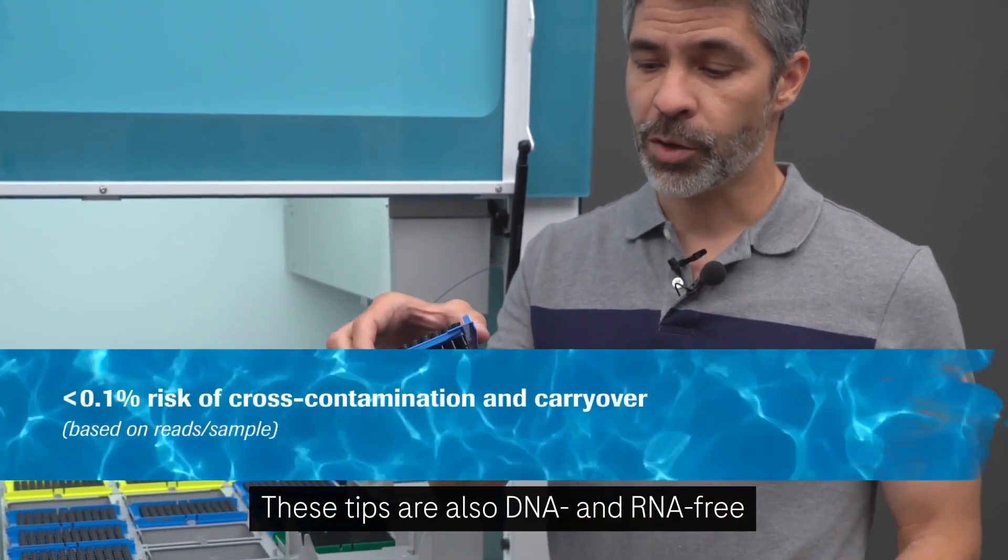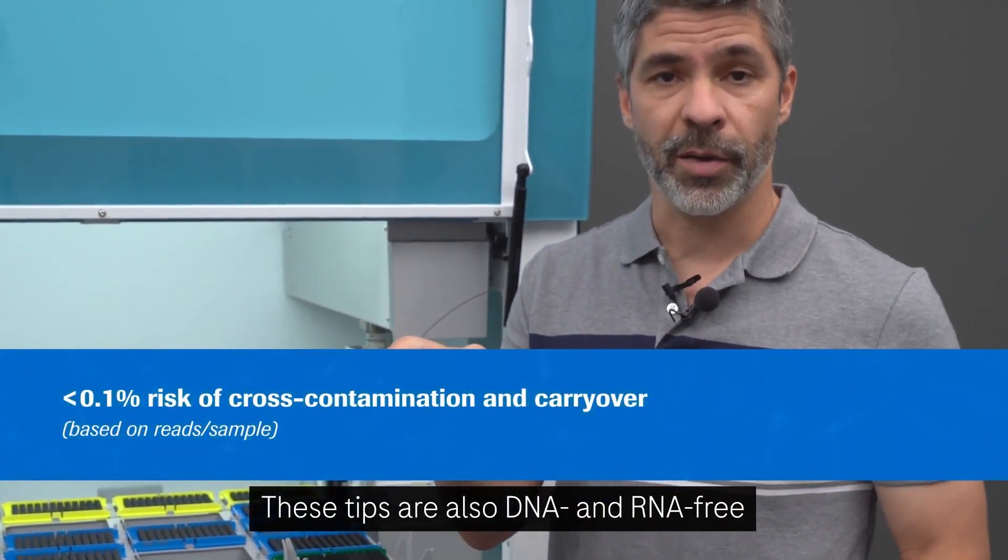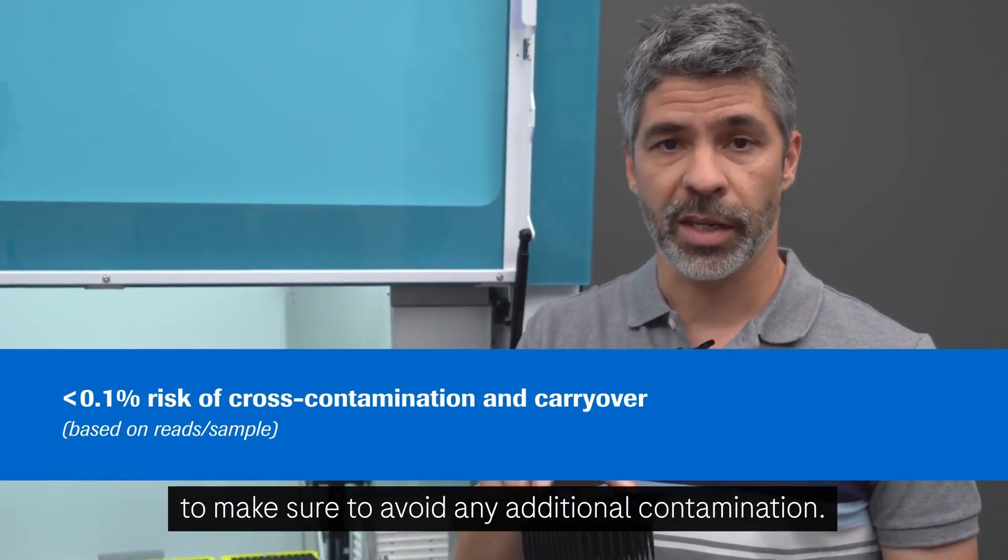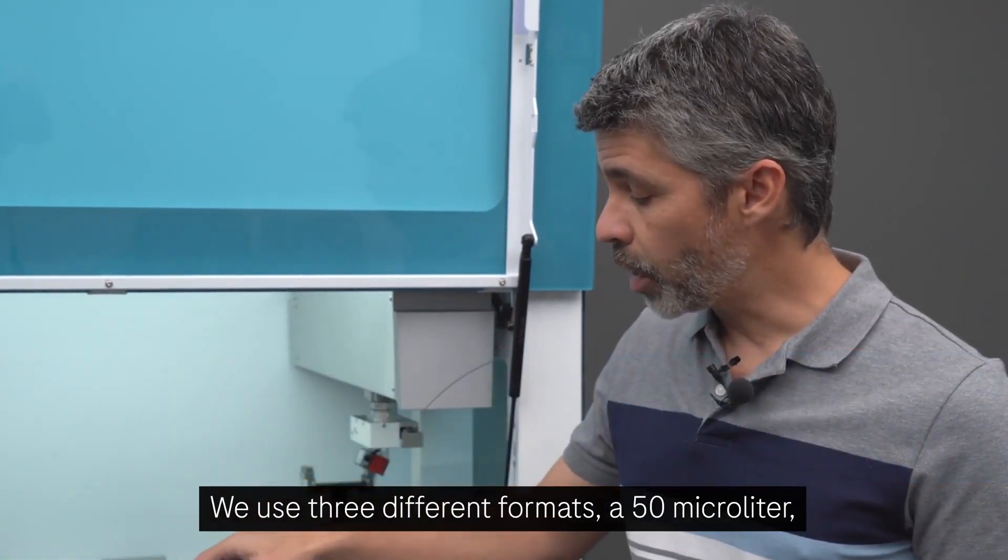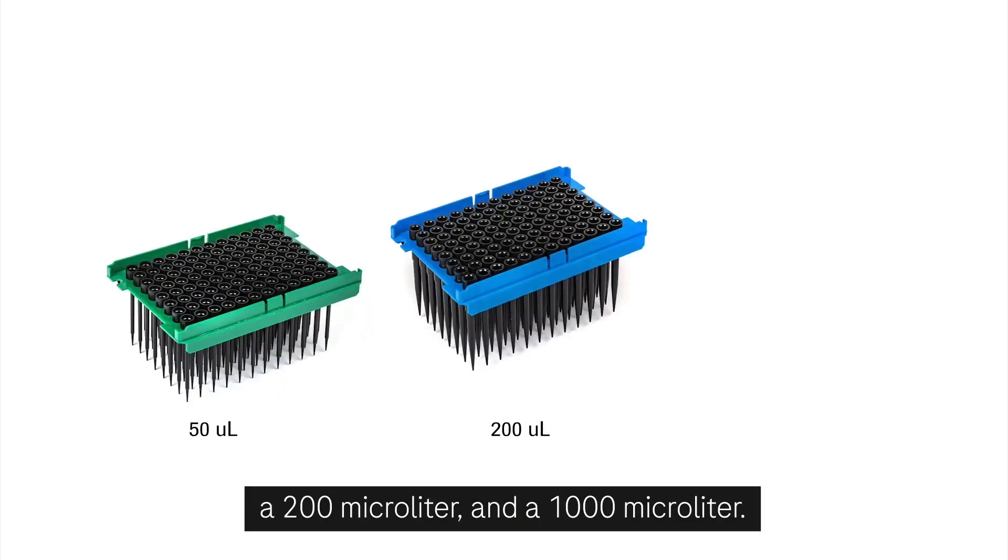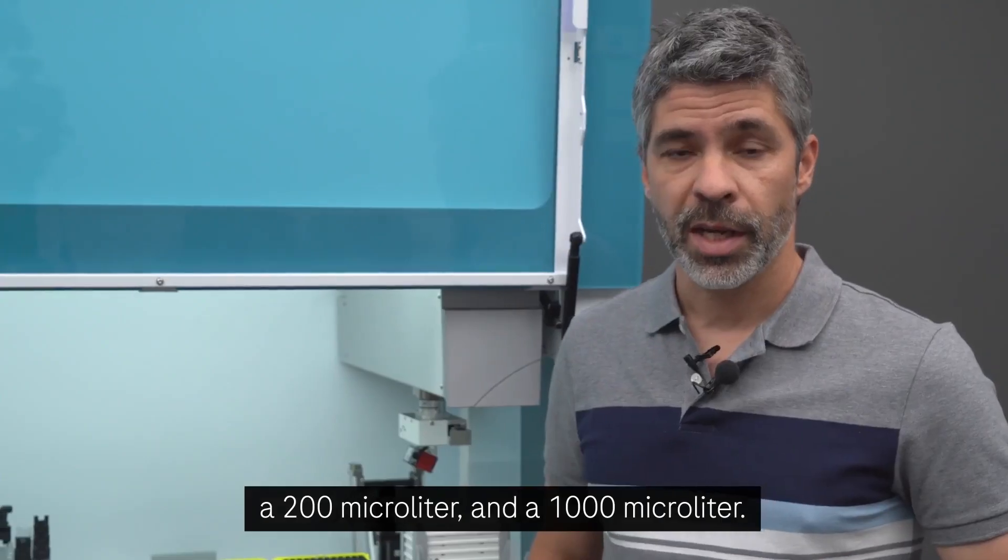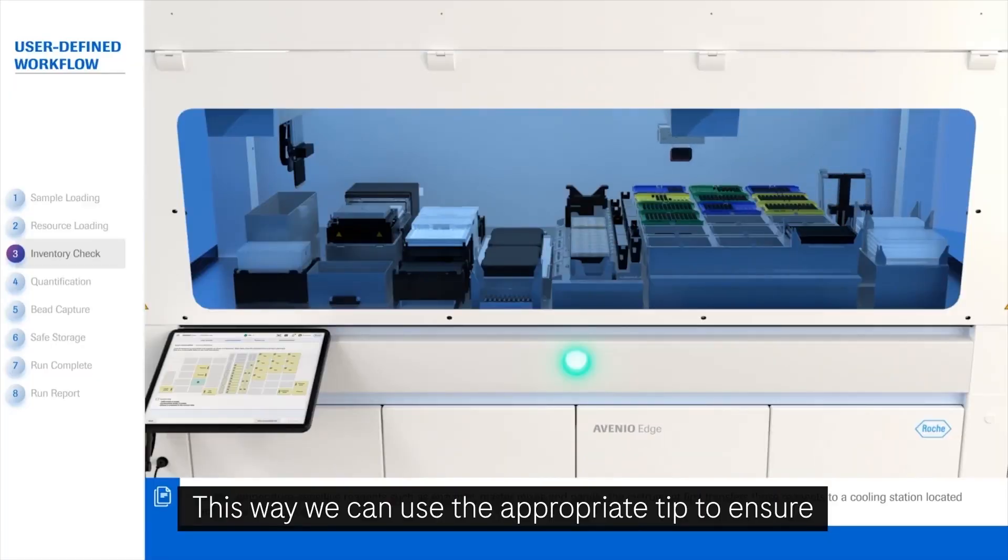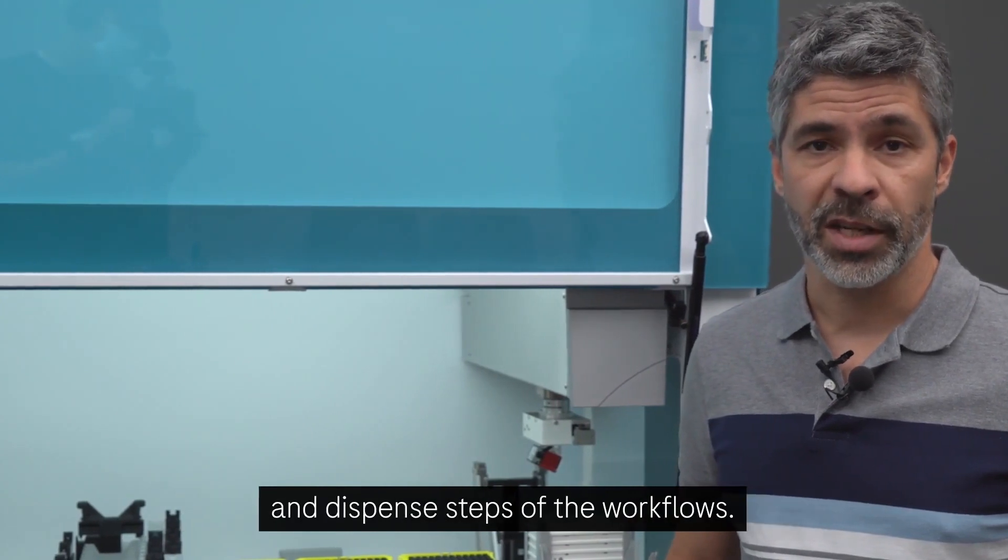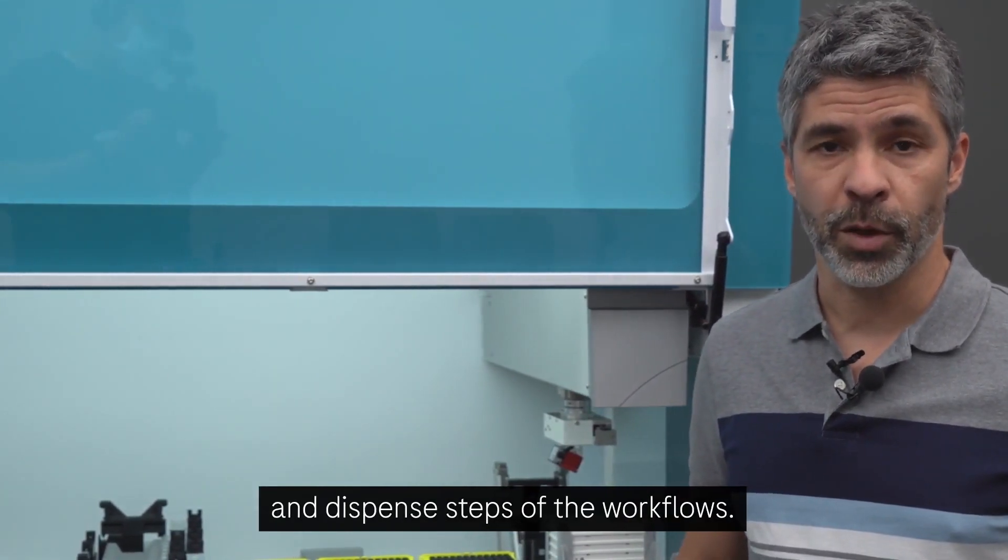These tips are also DNA and RNA free to make sure we avoid any additional contamination. We use three different formats: a 50 µL, a 200 µL and a 1000 µL. This way we can use the appropriate tip to ensure high accuracy of pipetting during the aspiration and dispense steps of the workflows.